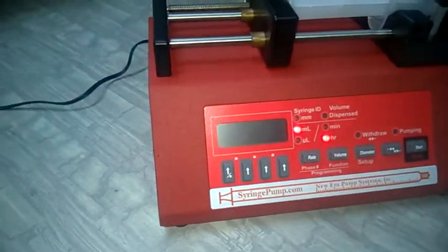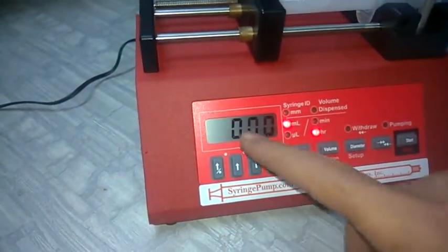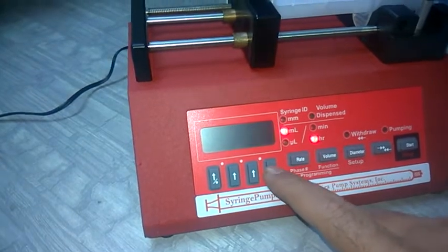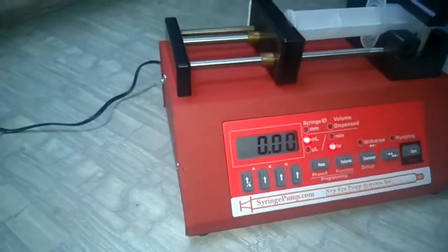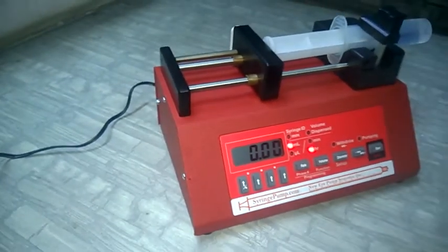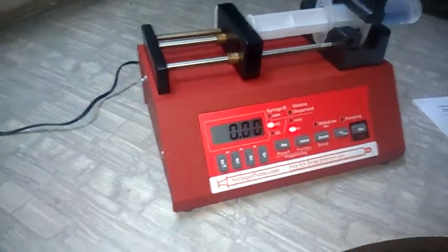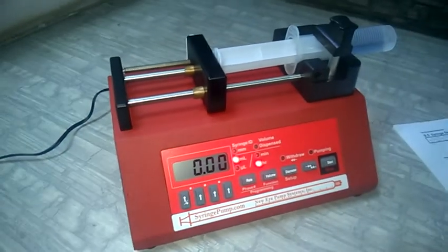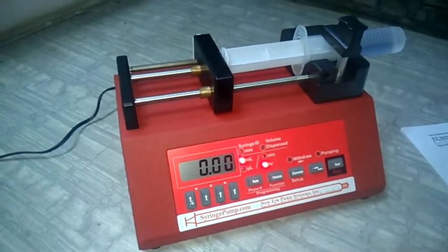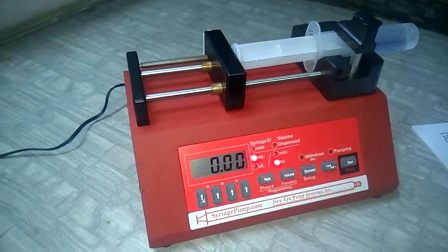Now the machine is on. If you press any arrow key, the flashing digits will stop flashing. In this machine there are only two parameters you need to set: one is diameter and the second is the rate. Diameter is very important because the pump uses it to calibrate the syringe and determine how far to move for a given volume.